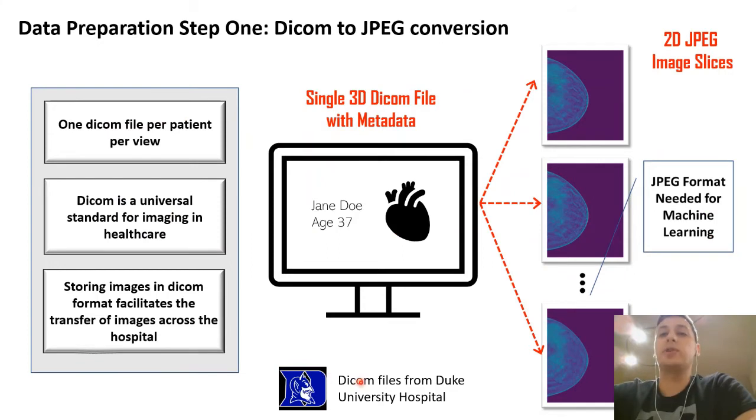The data set we used for our capstone came from Duke University Hospital. The reason that these files are in DICOM format is that DICOM is a universal standard for imaging in healthcare, and DICOM format allows for the easy transfer of images across the hospital. So the data set had 1 DICOM file per patient per view. Because we had 4 views per patient, we had 4 3D DICOM files per patient.